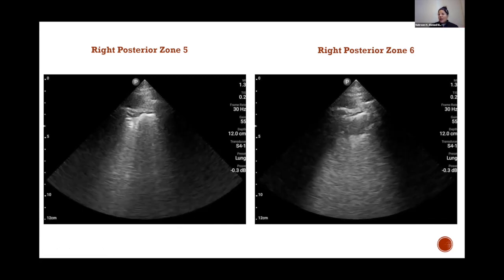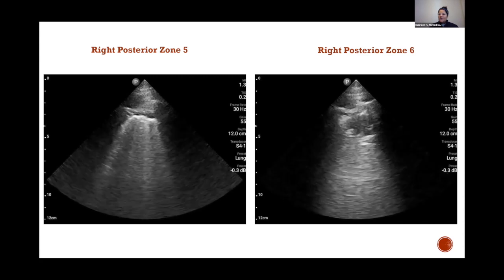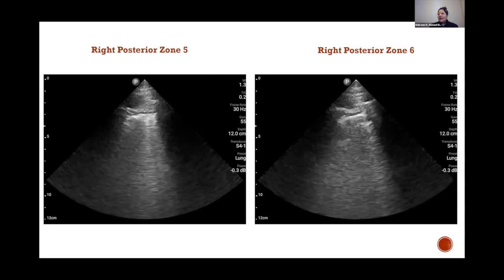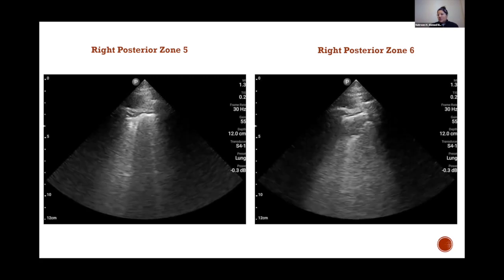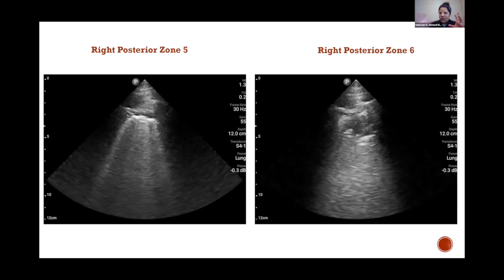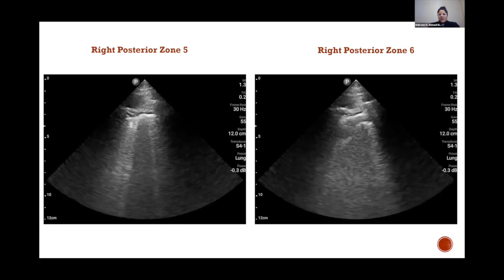But I want to point out that if you have a patient with ground glass opacities, oftentimes on a CT the radiologist will say, clinical correlation advised, because this could also be pulmonary edema if it looks like it's gravity dependent, right?